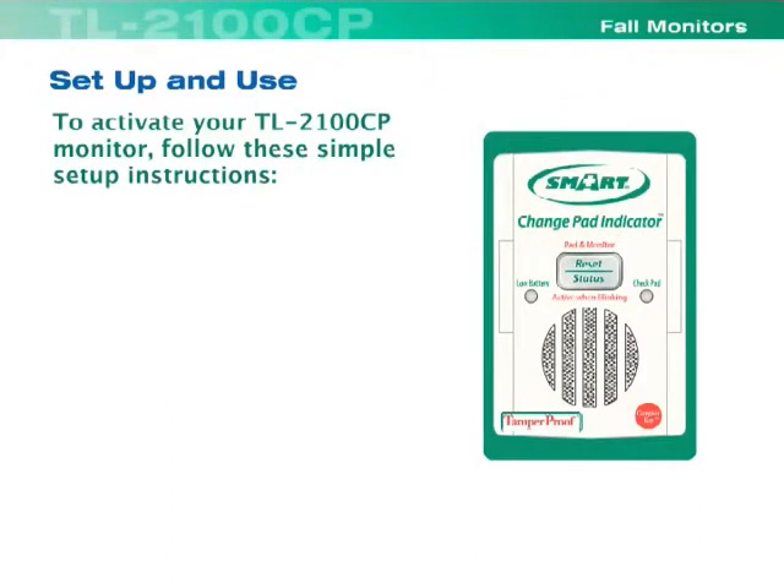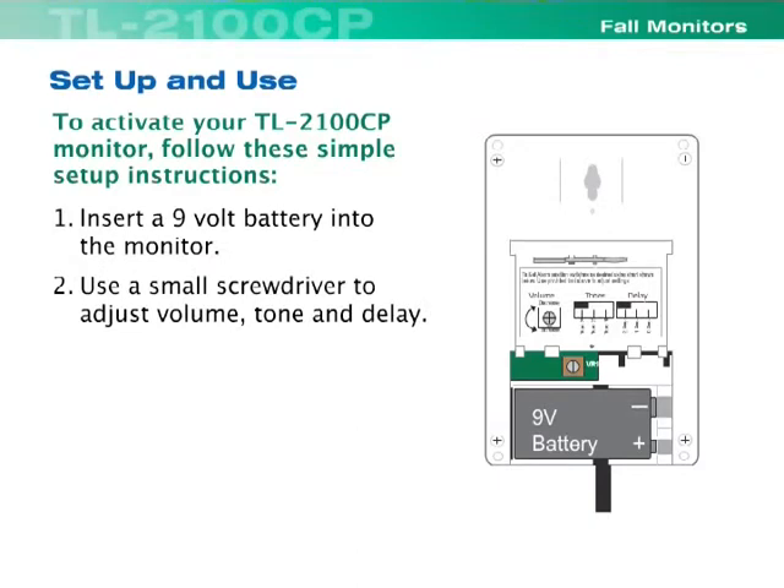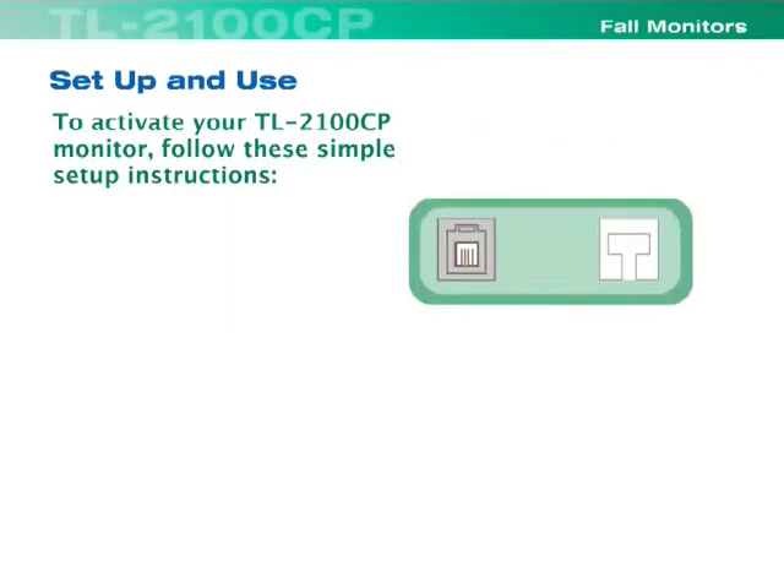To activate your TL2100CP monitor, follow these simple setup instructions. Insert a 9-volt battery into the monitor. Use a small screwdriver to adjust volume, tone, and delay.